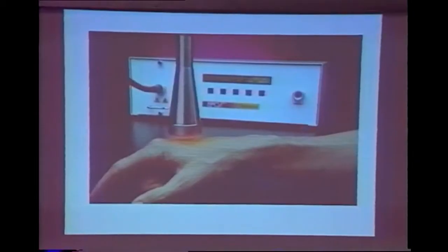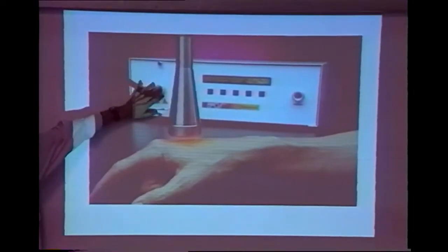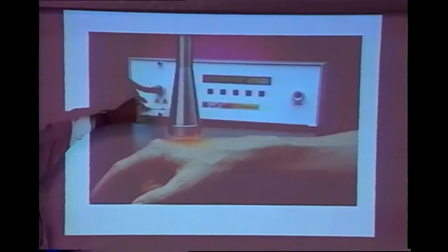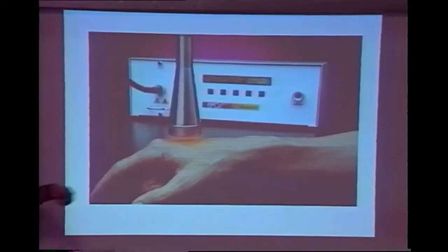Here's a nice map. I said that you cannot deliver light efficiently from a lamp into an optical fiber, but you can deliver light into a fiber bundle, or in this case, a liquid light guide. So if you can accept maybe a centimeter diameter bundle, then you can use this and deliver light quite nicely.